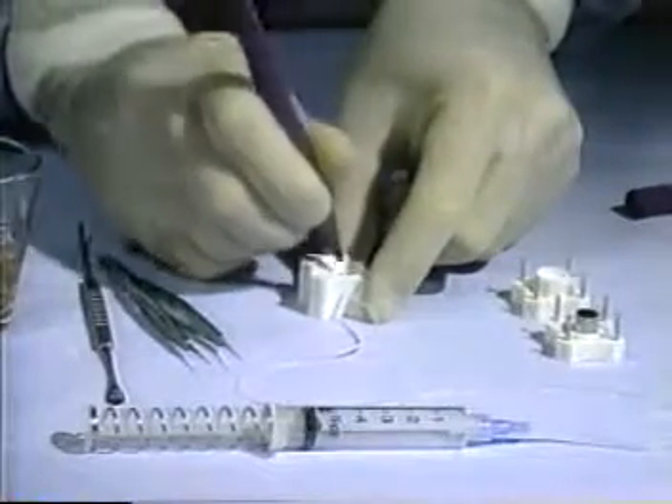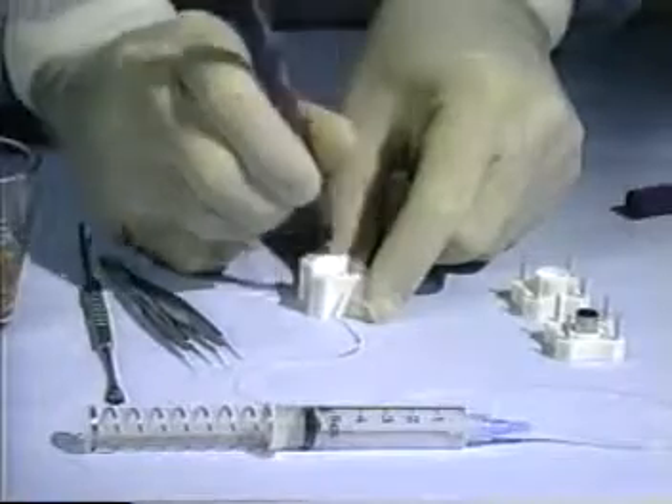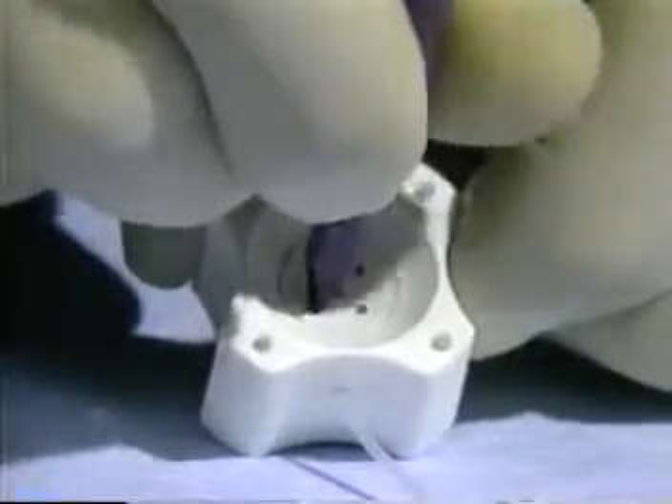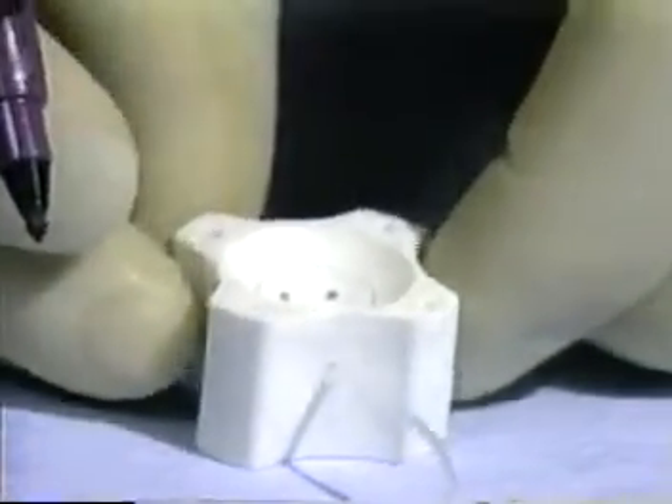The procedure for using the cornea punch begins with the instrument laid out on a sterile field. The tip of a surgical marking pin is placed into each of the four holes in the well of the cutting block and the pin is twisted until the sides of each hole are coated with gentian violet ink. The plunger of the syringe is pushed in all the way and held.